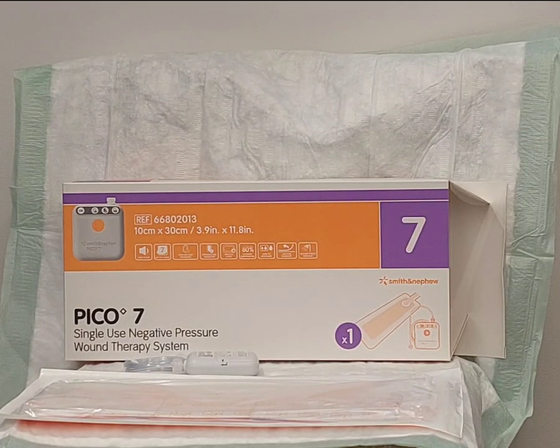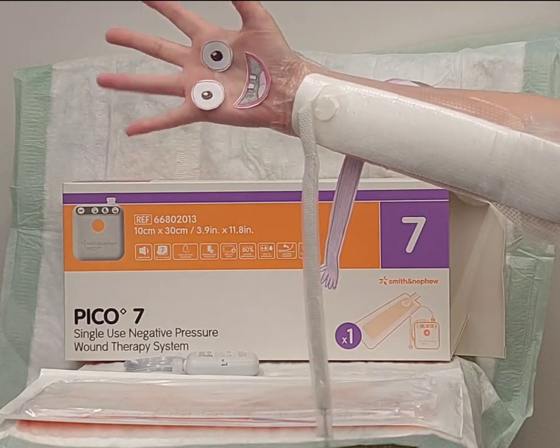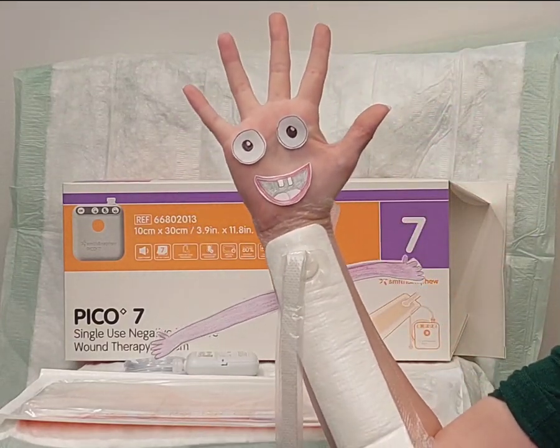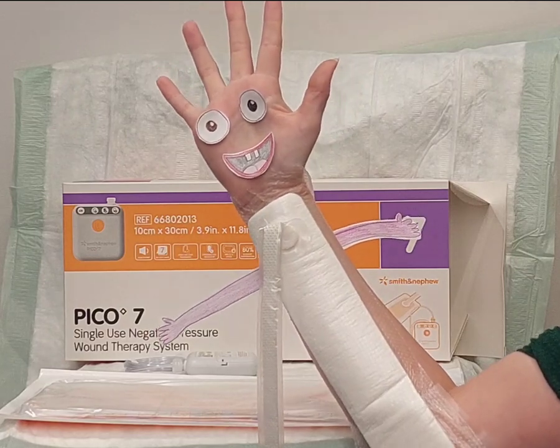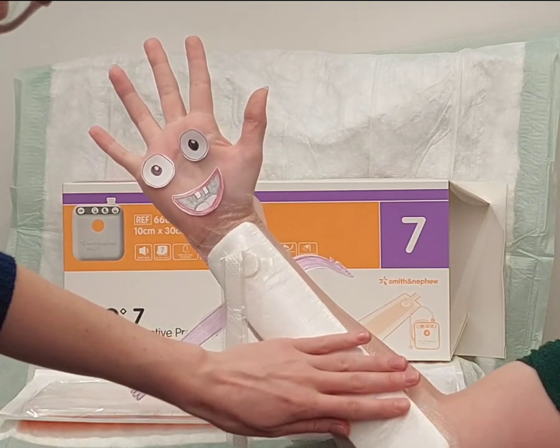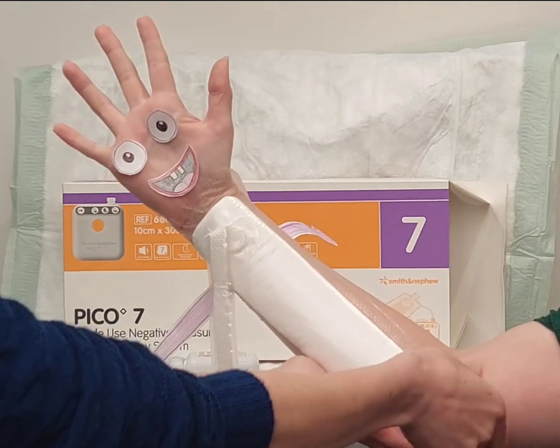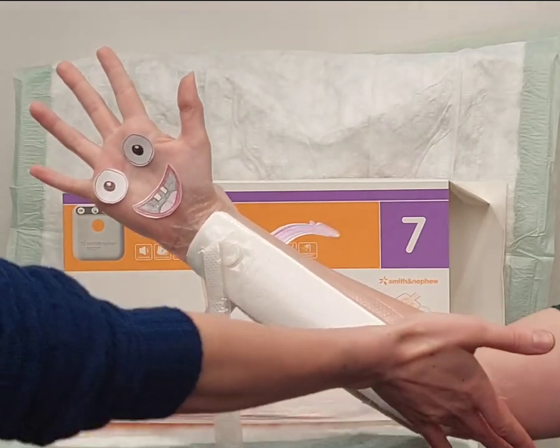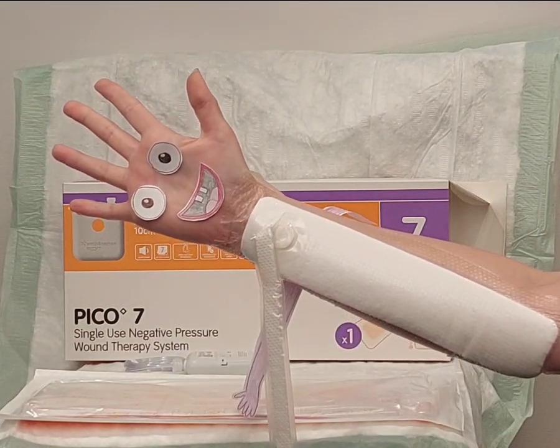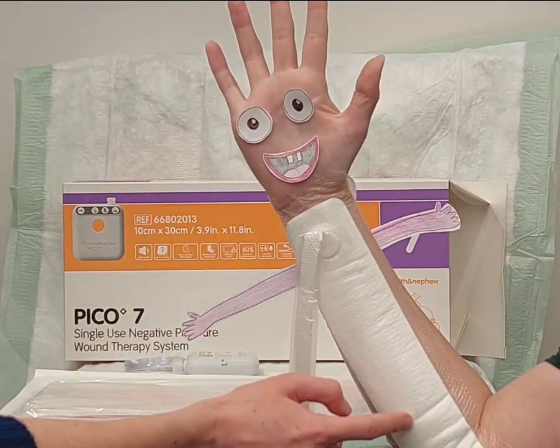Often patients arrive in the ICU with a Pico dressing already in place, but occasionally we are required to apply or change them. Prior to doing so, ensure the wound bed has been cleaned using aseptic technique. Then remove the backing plastic and place over the wound bed. The port should be placed higher than the wound bed, over intact skin and not over the wound itself.